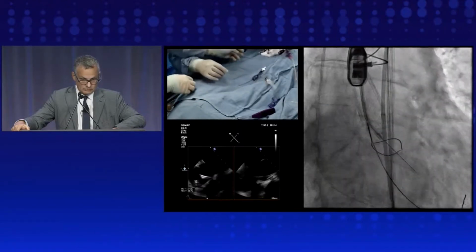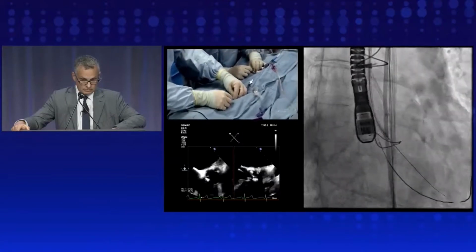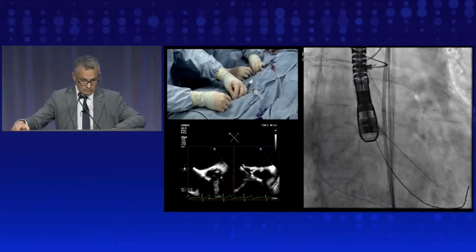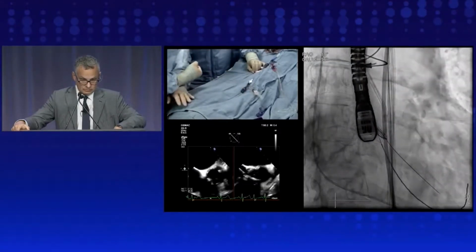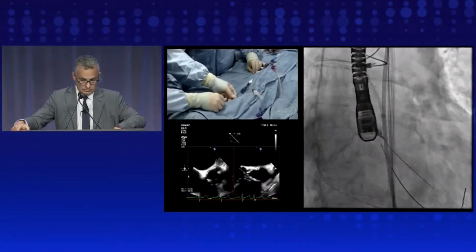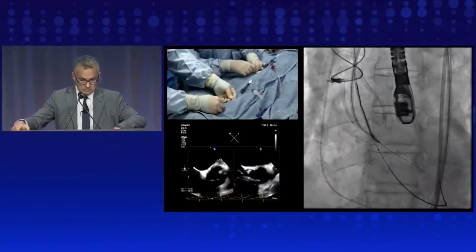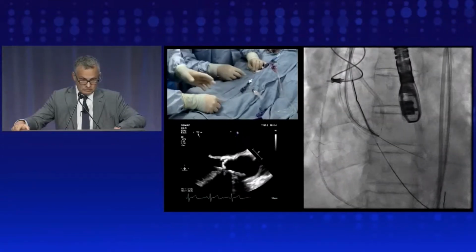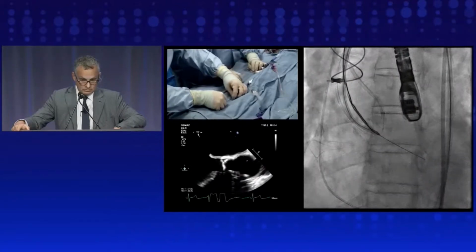So that's going through the leaflet of the right cusp. And now we'll try to snare it. Just to review what you see in the left ventricle, you see a platinum plus, and that's there just to support that there's no problem with repositioning the snare back and forth. If you wind up getting back into the aorta, you have no problem getting back into the ventricle. So he was able to traverse it.